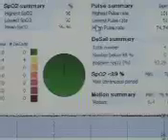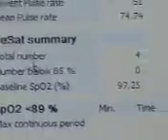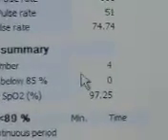So this was a recording time of 418 minutes, 409 minutes right here. Oxygen level of 98% with a low of 92. Was that just averages? Well, the highest would be 98 and the lowest would be 92. His average was 96. And it starts after he falls asleep? Well, this machine doesn't really know when you're sleeping, so it just kind of is on. It says right here on your software, and again, we haven't updated the software yet, that the total number of DSATs was 4.